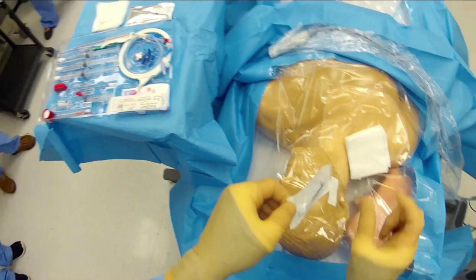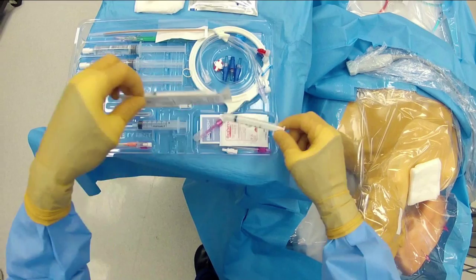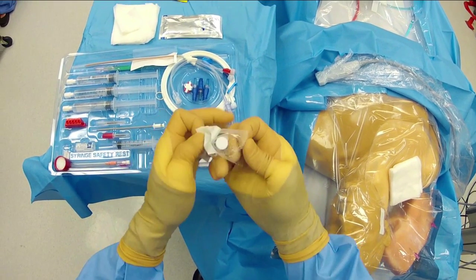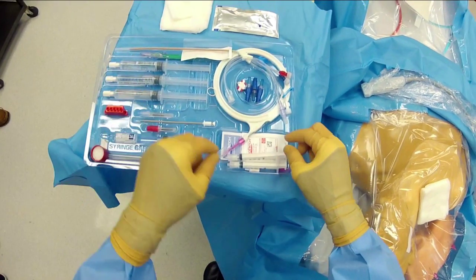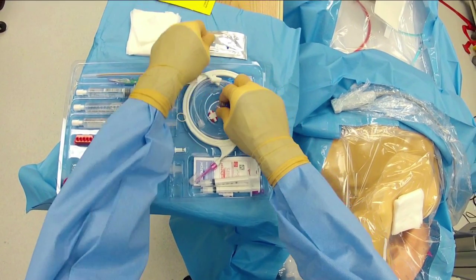The next step is to open up the syringes we'll use for our lidocaine. This kit has two syringes because of the needle safety technique — we can only use each syringe once. So we have one for lidocaine during the procedure and one for sutures.